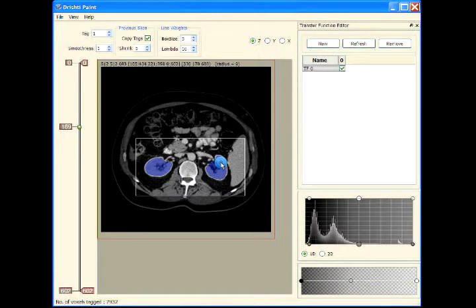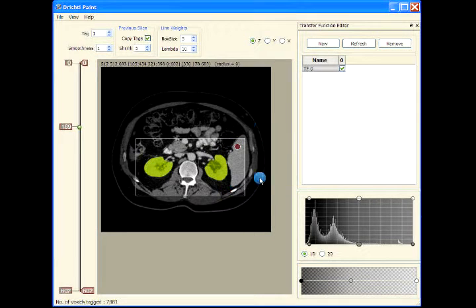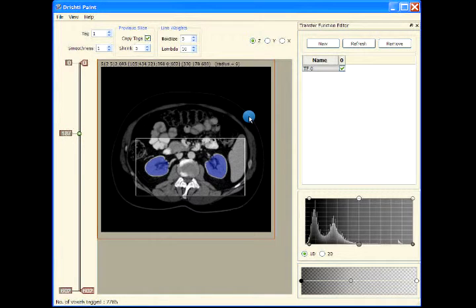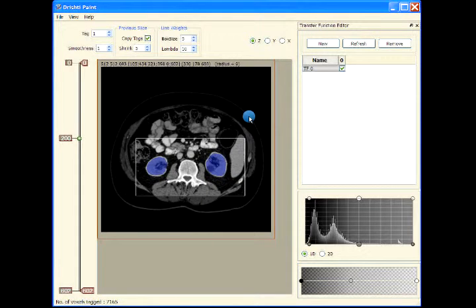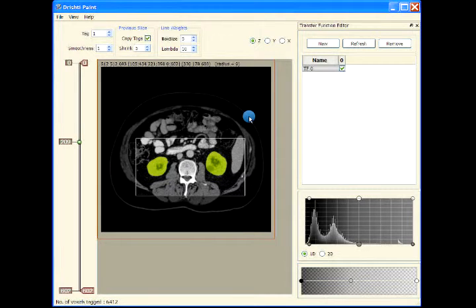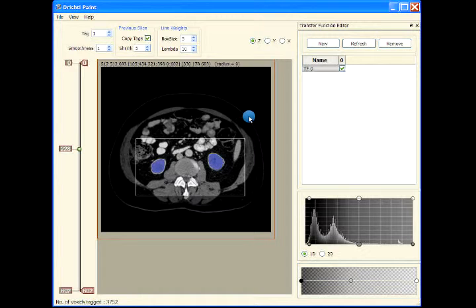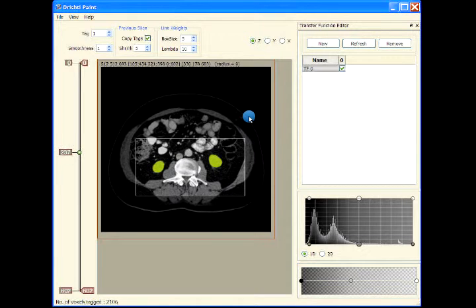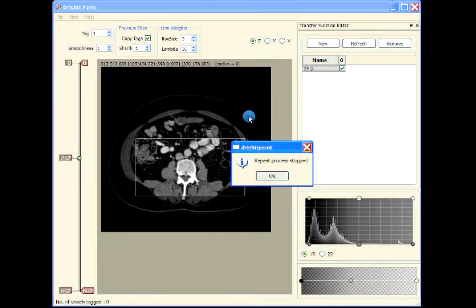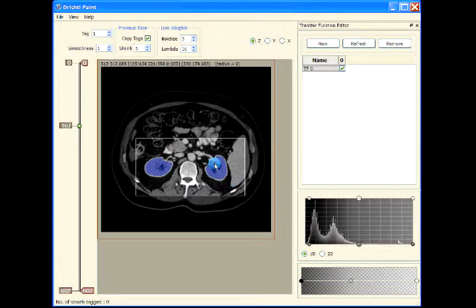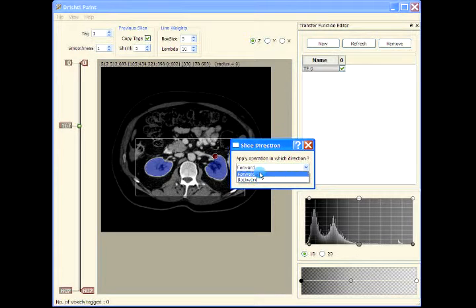Let's start applying the tag — press Shift+T forward. It's done. Now let's go backwards — start from here, Shift+T and go backwards.